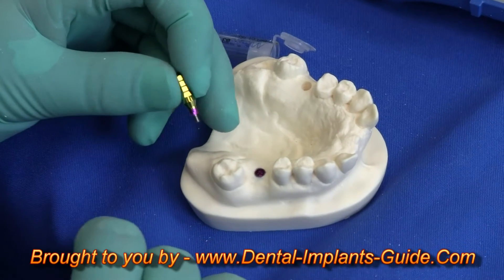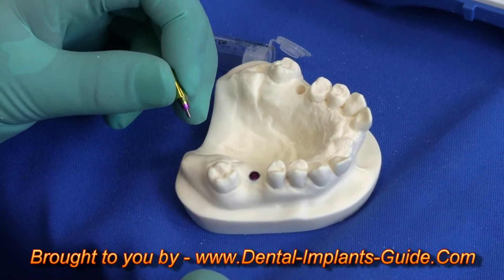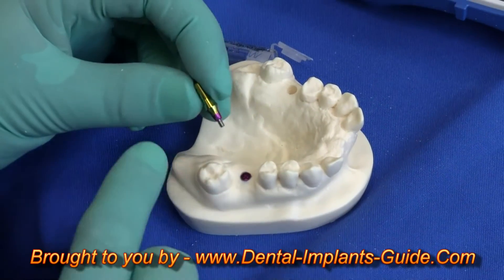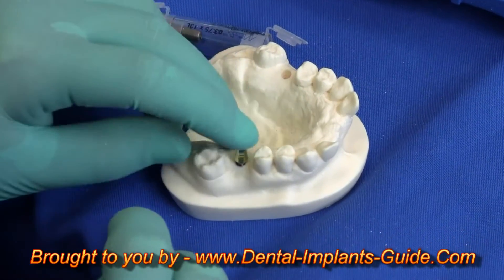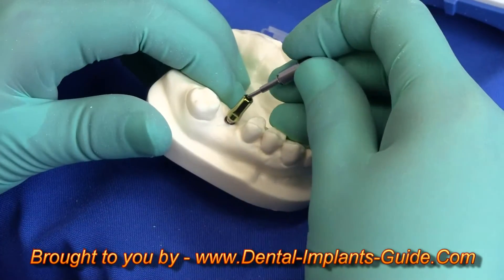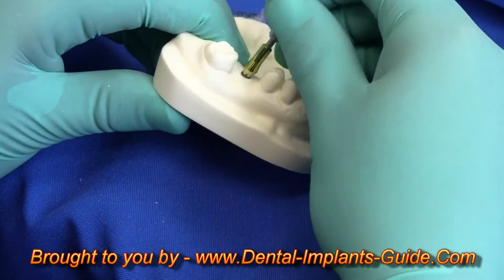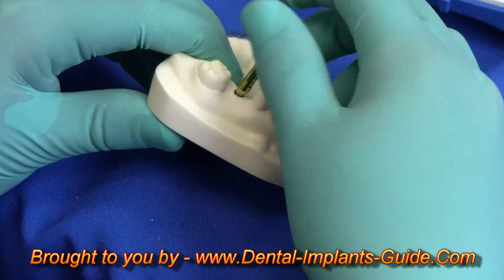The visible part of the abutment is gold-colored to help make a more natural-looking crown. You can see where the base of this abutment will be smaller than the diameter of the implant itself, which is platform switching.